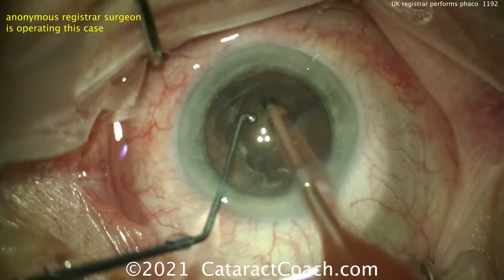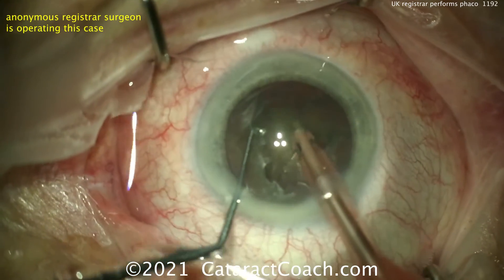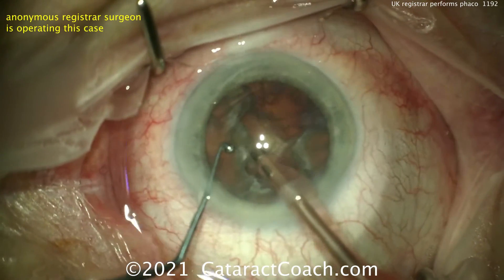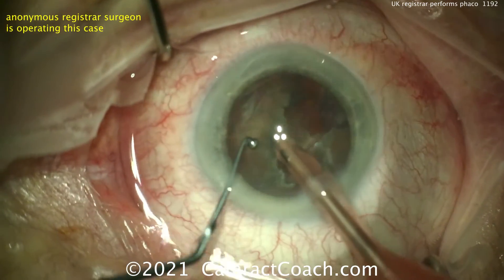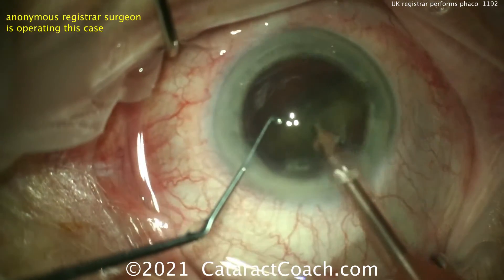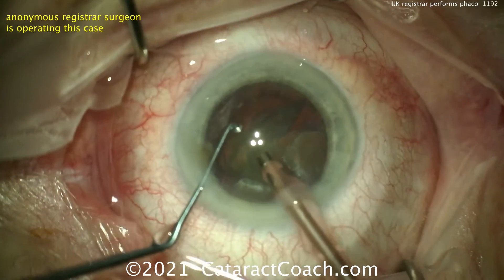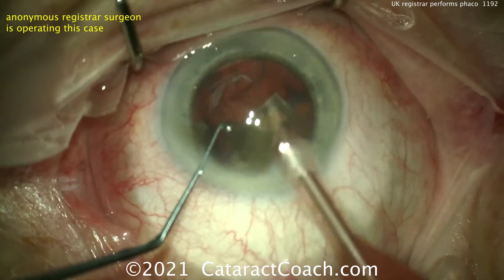Now moving to high vacuum, high flow to bring the pieces up out of the bag — quadrant removal. They come down pretty easily. That looks great, and here's the second one. Notice how the eye stays in primary position the whole case. I like that — that's a really great job. Also notice how the draping is good; there are no eyelashes in the field. I like that as well.